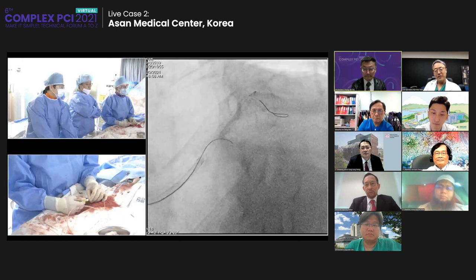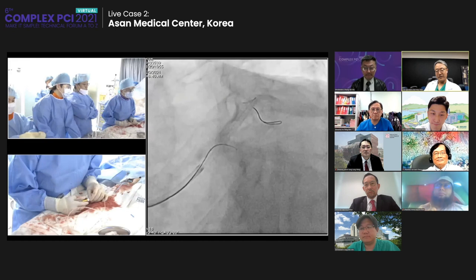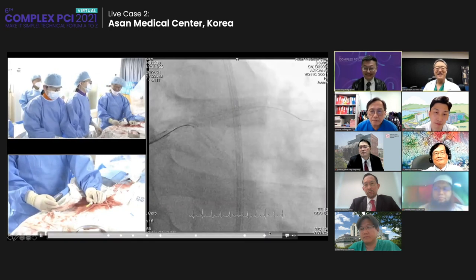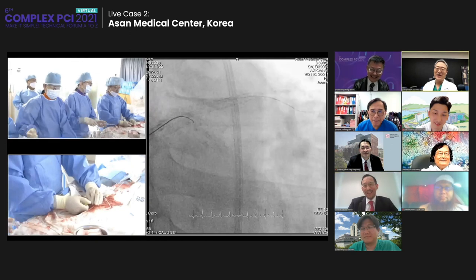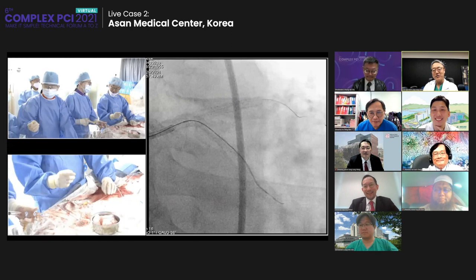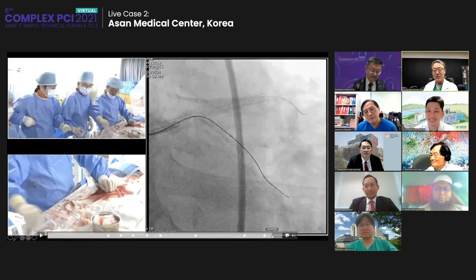Prepare one microcatheter over here. So over here still, okay, good. It looks like it's in. Okay, good, much better. This is too much short term. Finally, how long was your wiring? Over here it was 5 minutes. Okay, great, not too bad. Finally, I'm going to use the microcatheter as backup support with the Gaia Third wire, and then finally success.